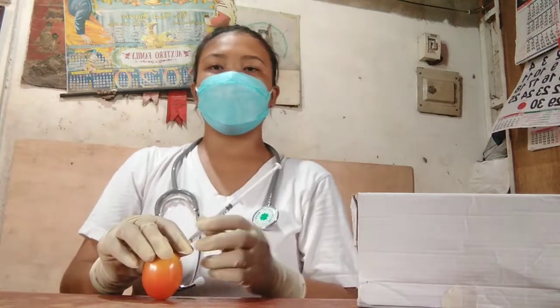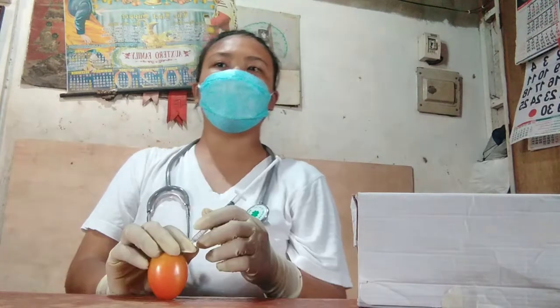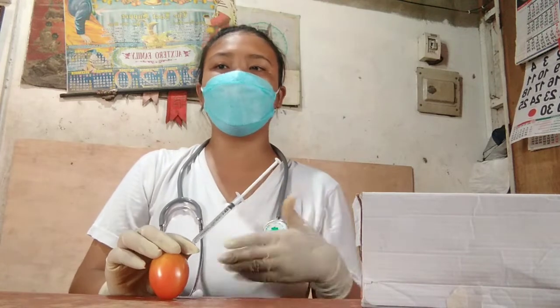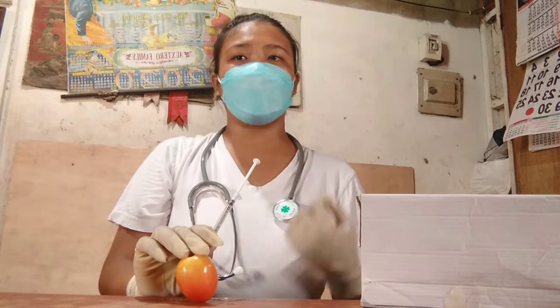Next, hold the barrel of the syringe steady with your non-dominant hand. Aspirate by pulling back on the plunger with your dominant hand. Aspirate for 5 to 10 seconds. A blood return indicates improper needle placement.